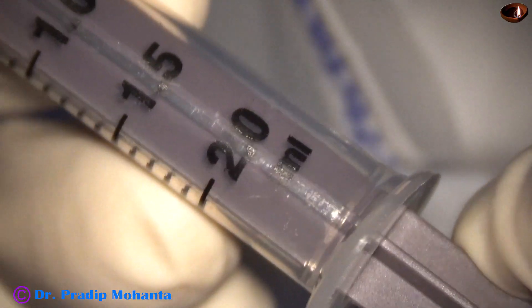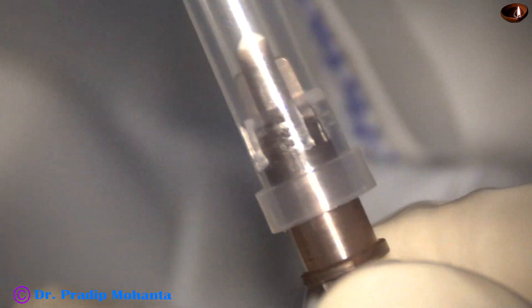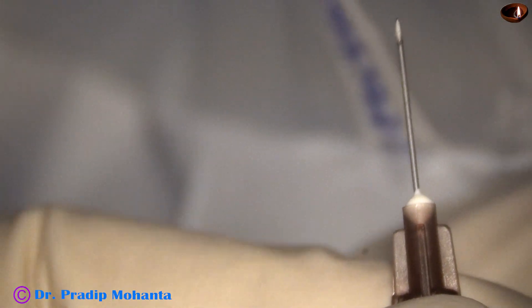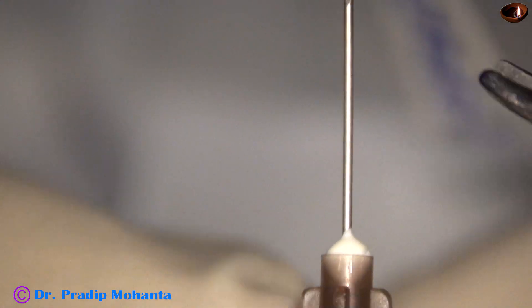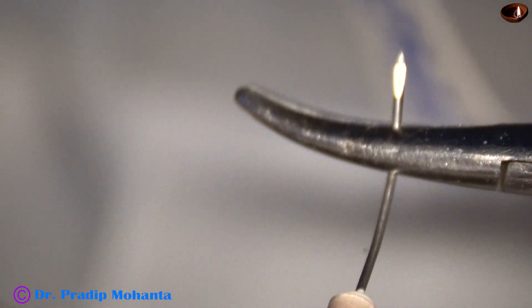I take this 2cc disposable syringe and its piston is removed. A 26-gauge disposable needle is attached to it. And now I bend the 26-gauge disposable needle twice so that it becomes easier to do paracentrasis.